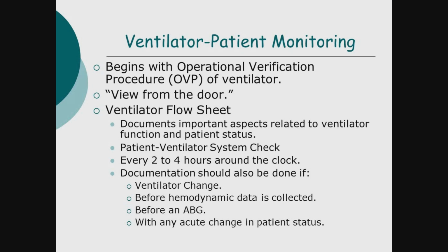All right. We know that this one is talking about monitoring of the patient as well as some of the non-pulmonary effects that happen when we mechanically ventilate somebody. Obviously, the beginning step is having a functioning ventilator, so you got to do that self-check prior to use.